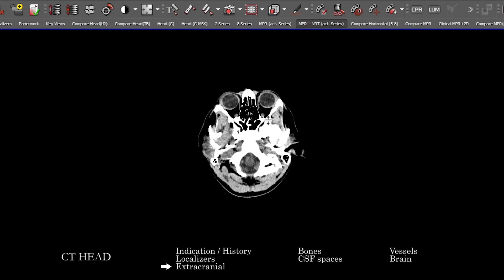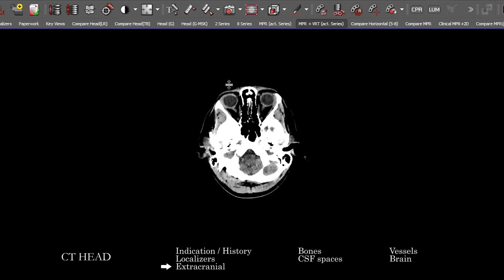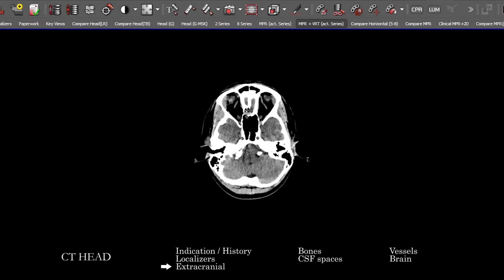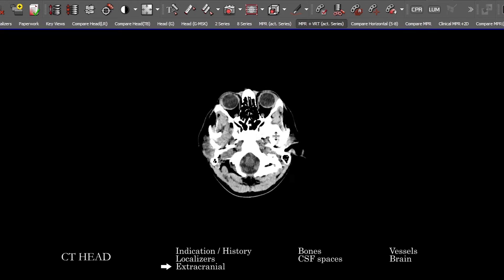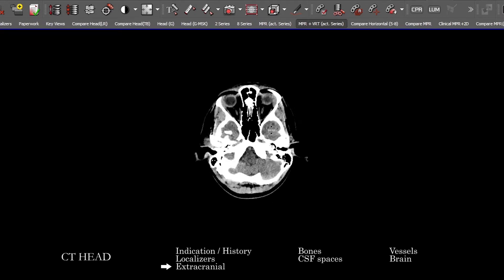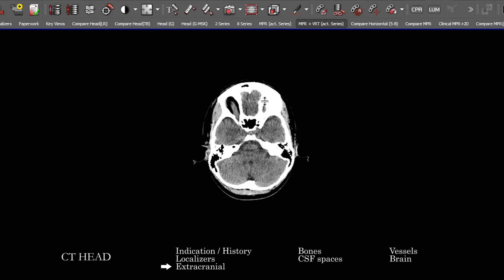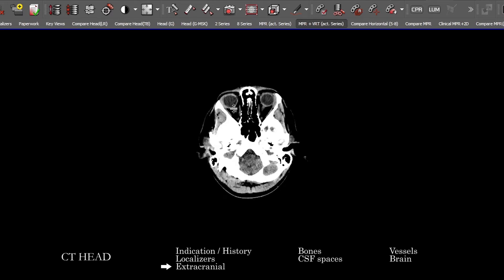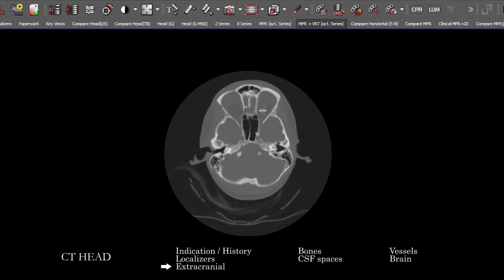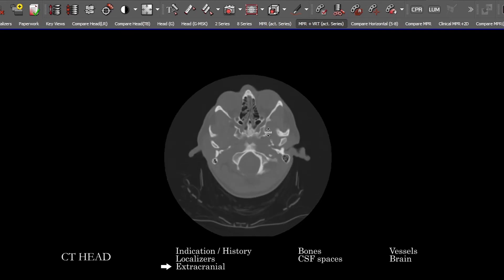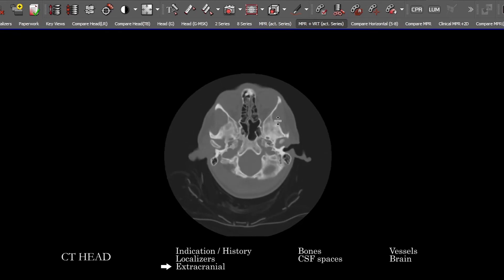Take a quick first pass of the orbits to look for collections, mass lesions, any abnormality intracranially and extracranially, and also of the globe. And then a first pass look at the paranasal sinuses and the mastoid cells, which we'll come back to.